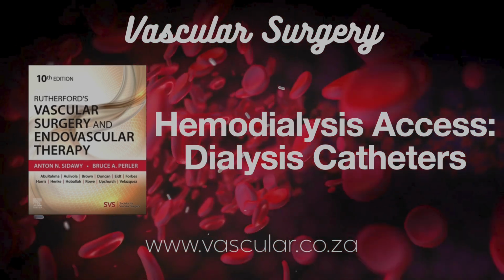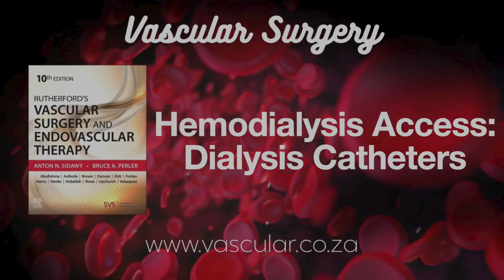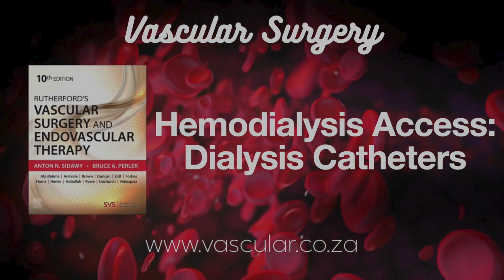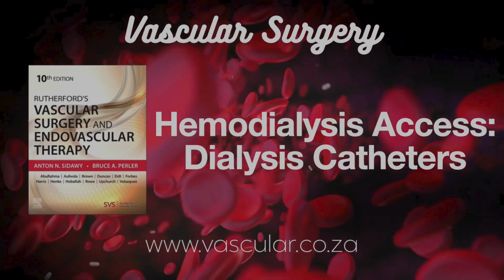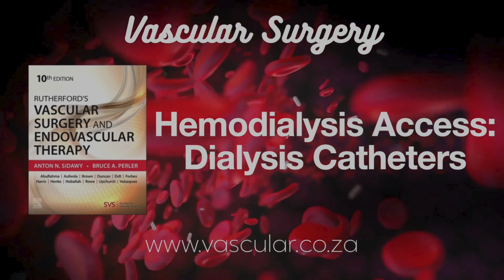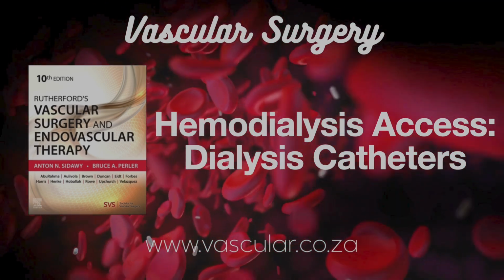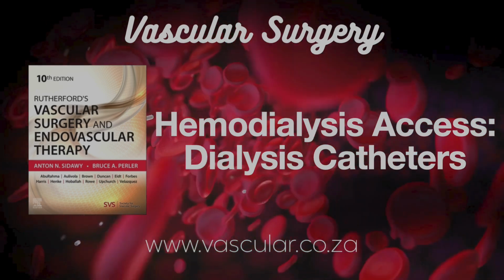Exactly, the tunneled ones. What's the key difference there, and why are they so essential when someone needs dialysis longer term, but maybe isn't quite ready for a fistula or graft? The big thing is that cuff. It's placed under the skin near where the catheter comes out, and tissue actually grows into this cuff. It does two things. Anchors the catheter really well, and crucially, it creates a physical barrier. Helps stop bacteria from tracking down the tunnel into the bloodstream. Okay, like a seal almost? Pretty much, and that allows for much longer use compared to the non-cuffed acute type.